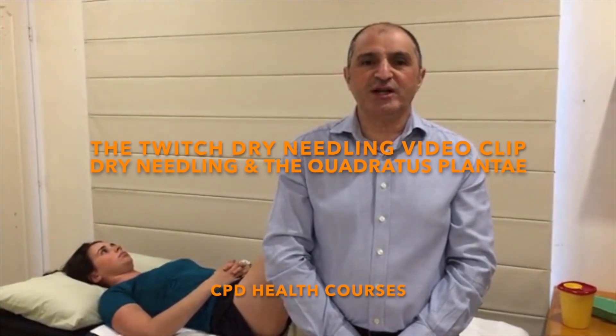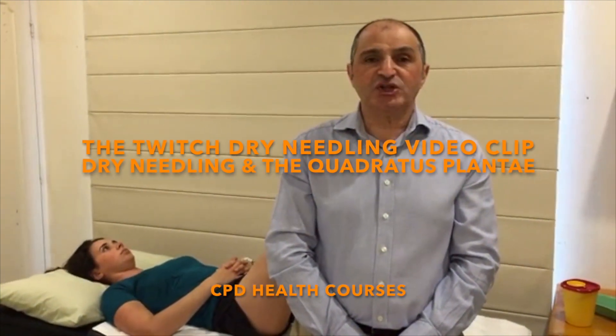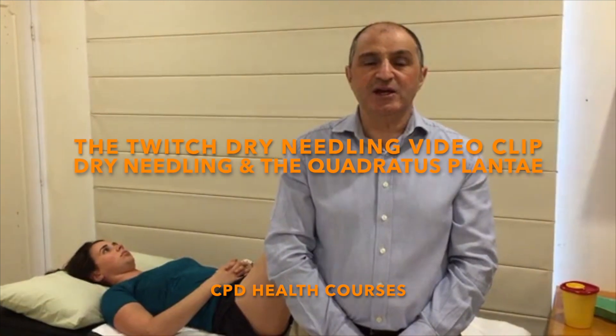Welcome to the Twitch dry needling video training series, where I'll share a fantastic dry needling technique followed by a manual therapy technique to get great results for your patients every time.